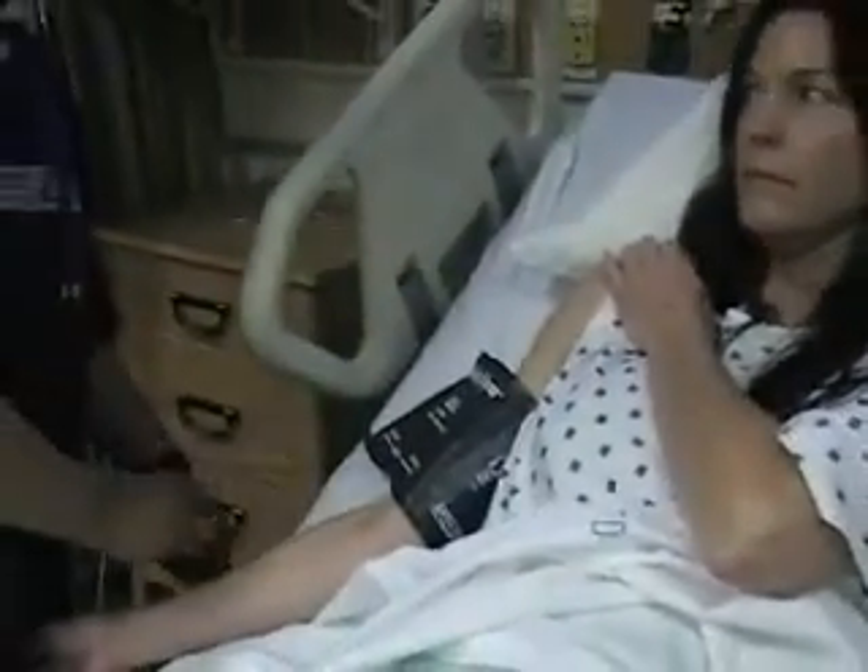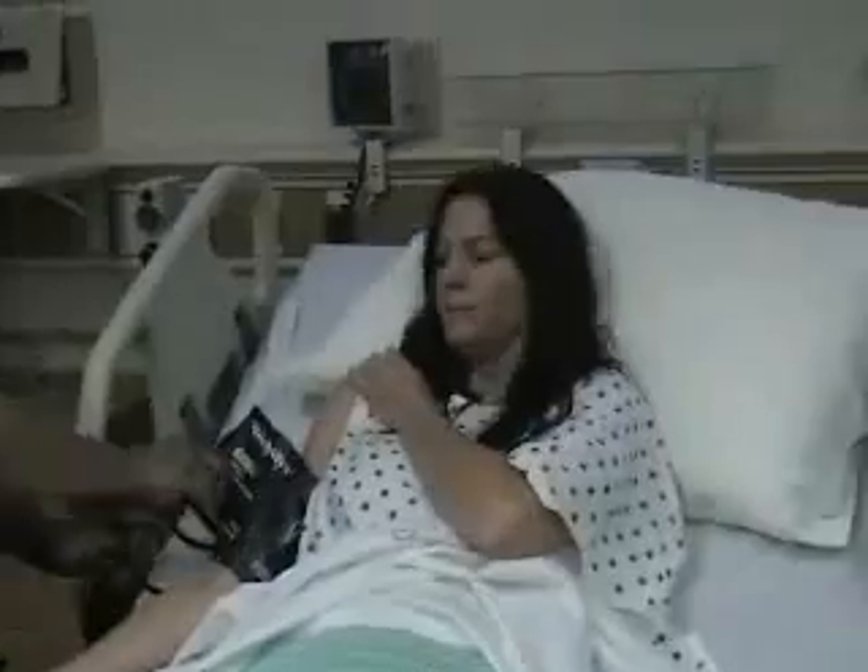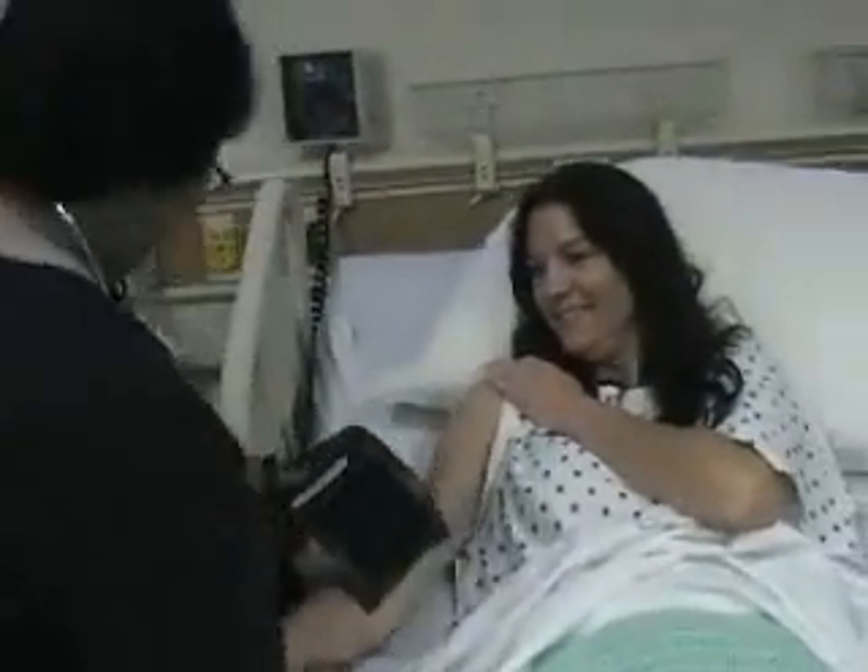Now she released it because she must have heard a sound. It's 108 over 58. Good. Very good.